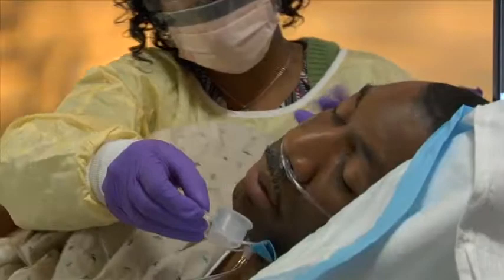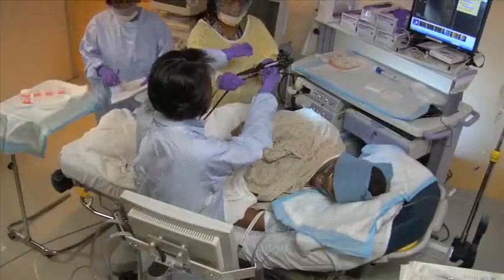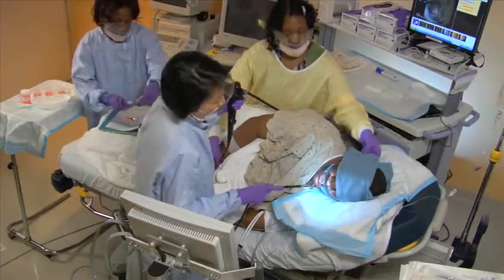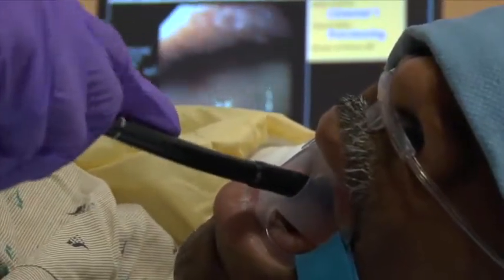Once you are comfortable, a supportive mouthpiece will be placed to help you keep your mouth open during the procedure. Then, your doctor will gently maneuver the endoscope into position. As the endoscope is slowly and carefully inserted, air is introduced through it to help your doctor better see the images. Your physician will use the endoscope to look closely for any problems that may require evaluation, diagnosis, or treatment.